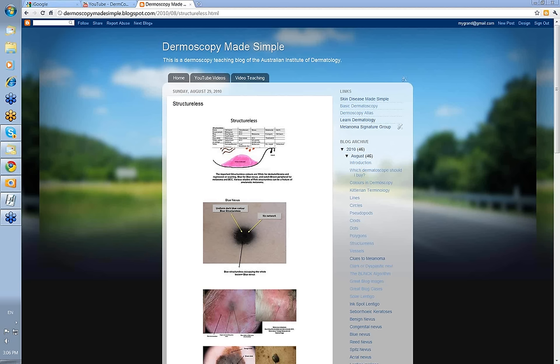You get your various lines: reticular, curved, branched, peripheral, and also white lines in the center of a lesion. If you don't find any lines, then you look for pseudopods, then circles, then clods, then dots. And if none of those are present, then you end up with Structureless.